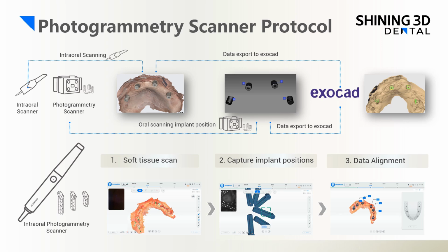Using the Aoralscan Elite for full arch implant restoration data acquisition is highly efficient. You can complete bite scanning, soft tissue scanning, implant position capturing, and data alignment all within the same software and within a single order. The entire process takes approximately 10 minutes.